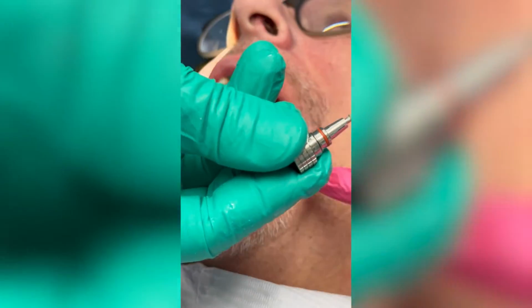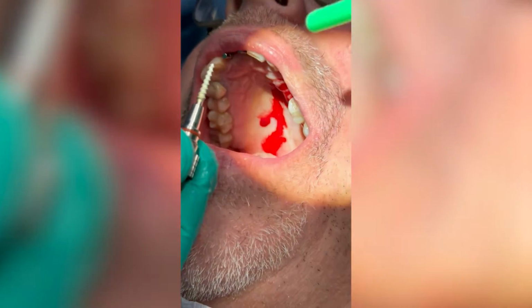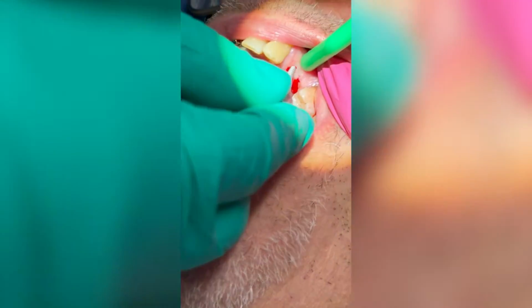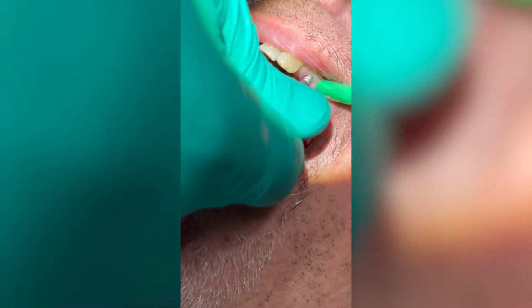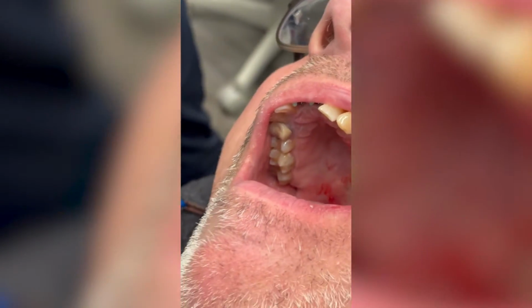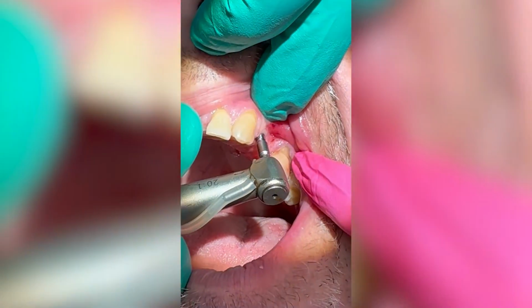Okay, so we're going to go ahead and make our 2 pilot holes, and we're going to go ahead and place the next 2 implants. And these are 3.0 by 13 implants. Suction, please. You can open the next implant, please. It's open. Okay. And again, we have 30 Newton centimeters of torque.